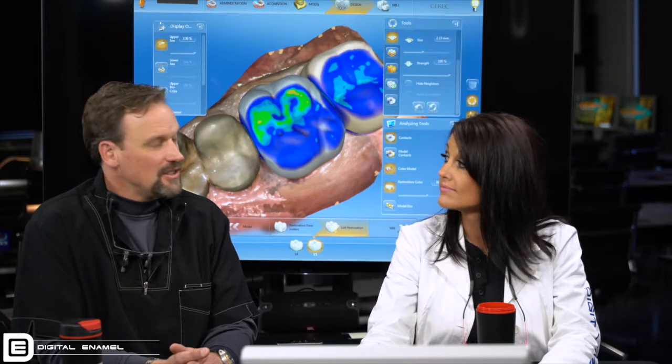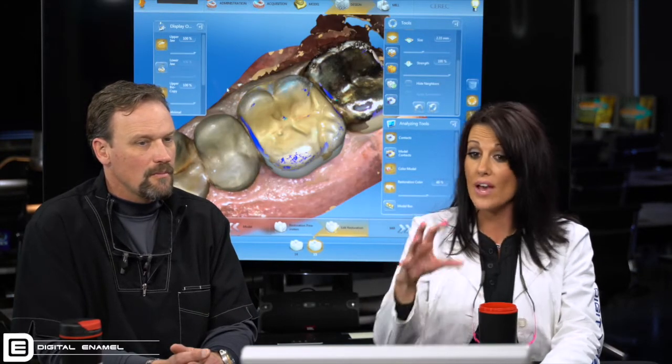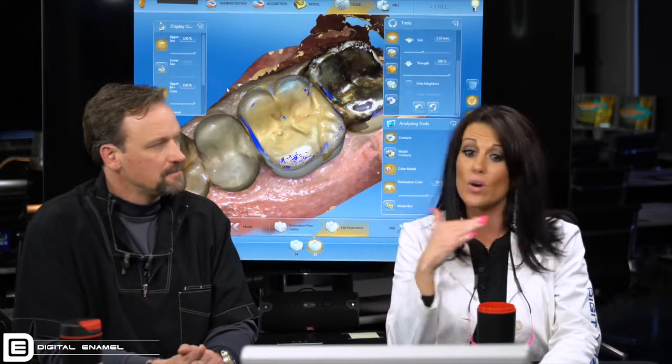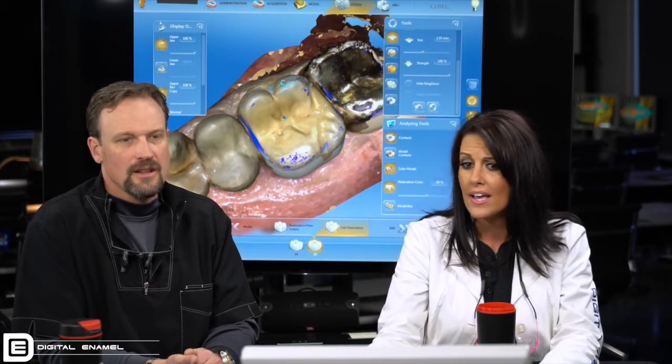You discovered that lateral interference years ago. So we know that when they're going side to side, forward and backward, that's going to be okay. But in this particular situation, it feels like we have to push it down. Just trust that you have put them back to where they were before you touched them when they came in, and what they have worked out years ago with this gold crown on number 15. As soon as you see that, you think you need to adjust it — but what's going to happen as soon as you touch that and take it down is they're going to be out of occlusion.